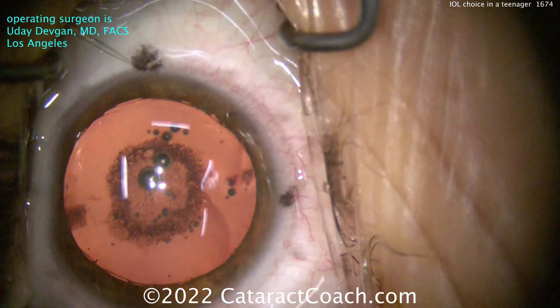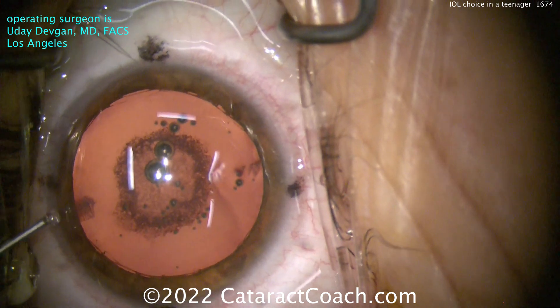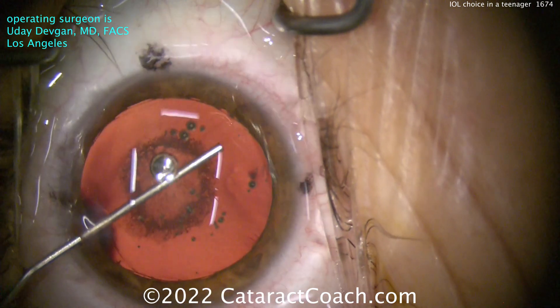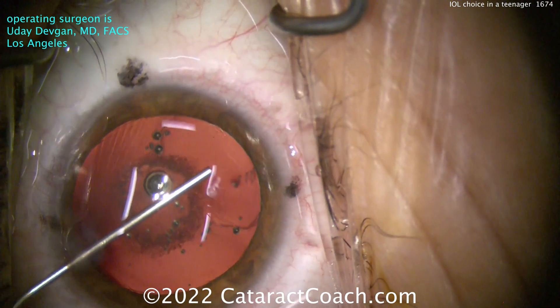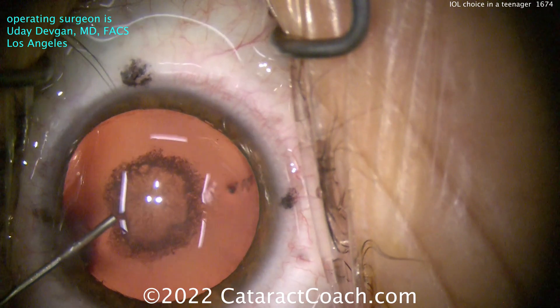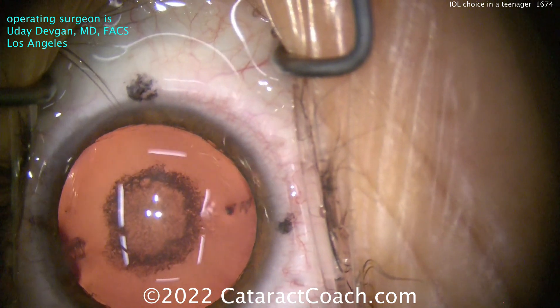Now I can increase the brightness. So in this case, what lens do you put in the eye? The patient is starting off with a little bit of a hyperopic refraction — about one diopter of overall hyperopia and about a diopter of astigmatism with the rule.